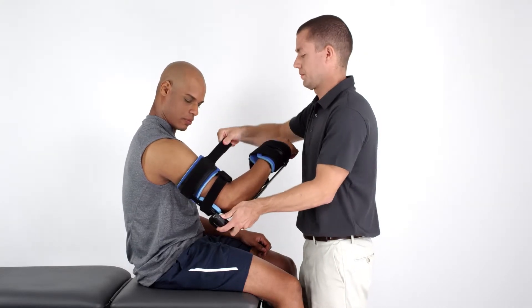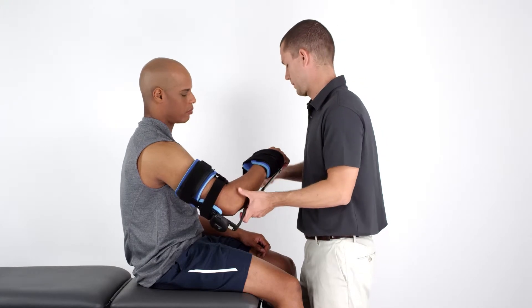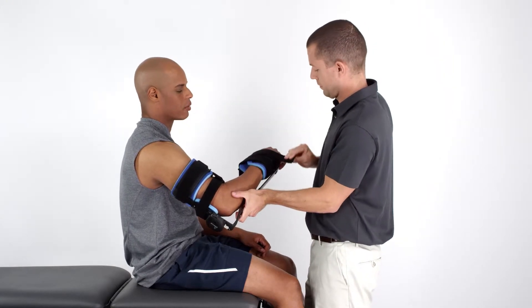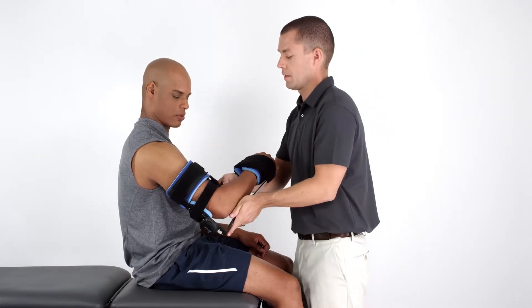Once you've adjusted and positioned the orthosis on the patient's arm, secure the straps. First, secure the proximal and distal straps. Then secure the middle strap on the arm.